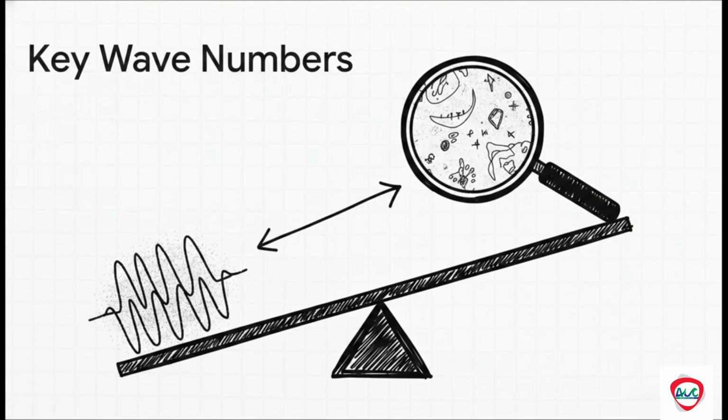Now, every single sound wave you create is defined by 4 key numbers: frequency, wavelength, propagation speed, and period. But the absolute most critical relationship you need to lock into your brain here is the one between frequency and wavelength. When you crank up the frequency on your console, you automatically shorten the wavelength of that sound wave. Why do we care? Because a shorter wavelength is your golden ticket to unlocking ultra-fine image detail.